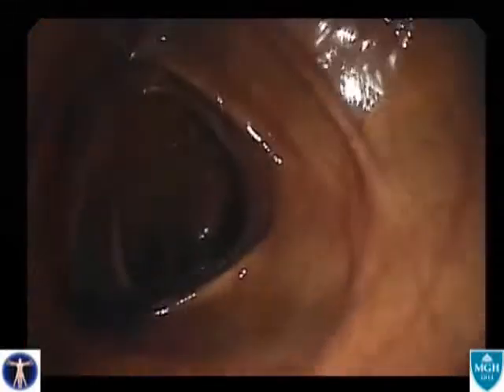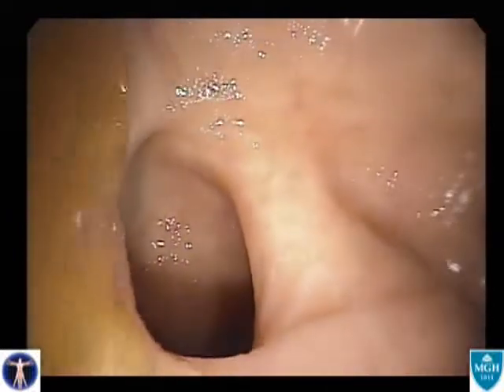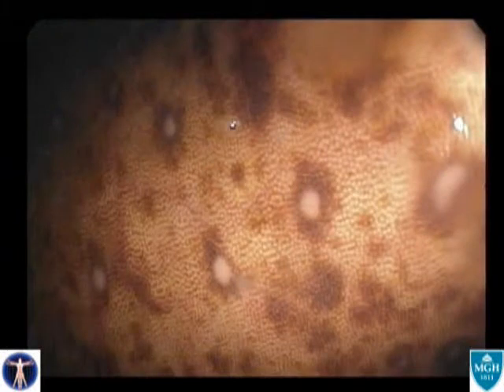Melanosis typically is most intensive in the cecum and diminishes in intensity down the length of the colon. Characteristically, the terminal ileum is devoid of any pigment uptake, as seen here. Okay, so why this pattern? What can we learn about melanosis by looking closely at this endoscopic picture?